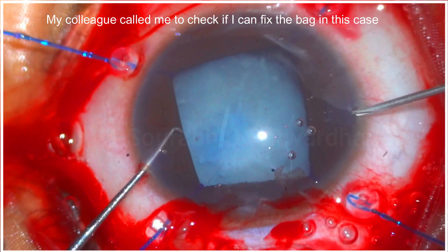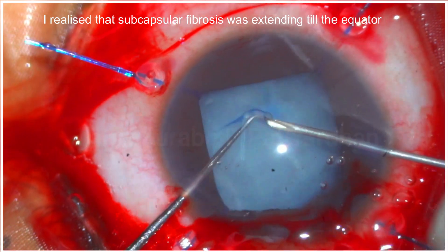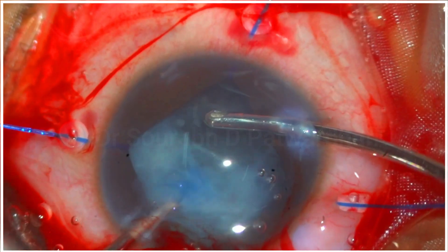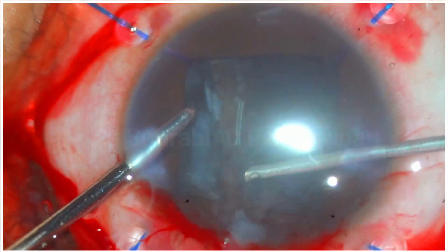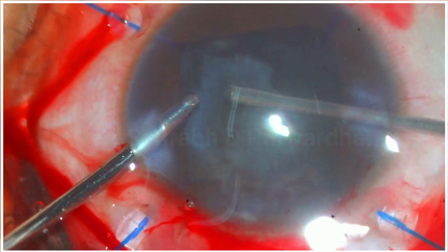My colleague was supposed to operate this case, so he called me to check if I could fix the bag. Earlier the pupil was not dilating, so once iris hooks were put, he could see there was a subluxated bag. When I checked it, I realized there was a lot of subcapsular fibrosis and subluxation, with fibrosis going all the way to the equator of the lens.